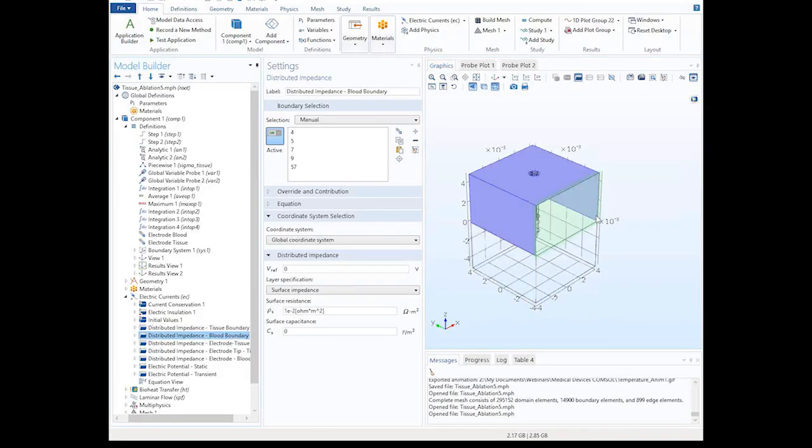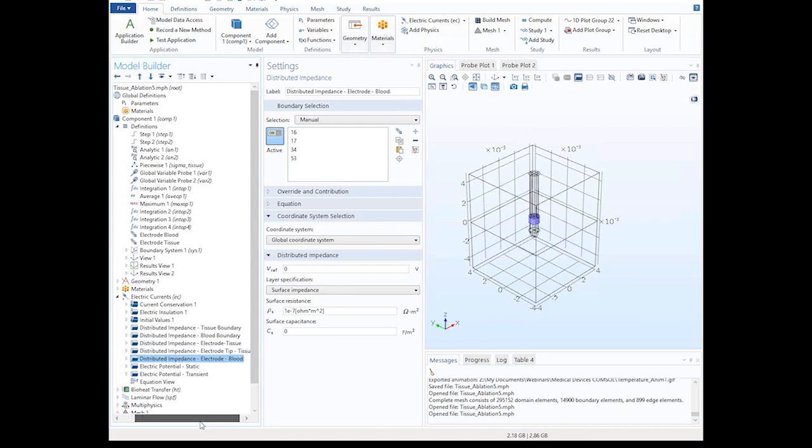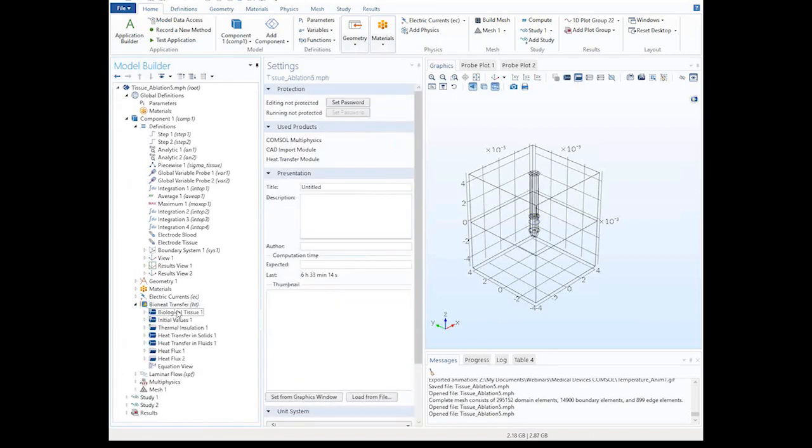There's also impedance between parts. This is between the electrode and the tissue, and also between the tip of the electrode and the tissue, and between the blood and the electrode. But that's it. That's all the physics that's needed here. The bioheat equation is applicable also to the whole geometry.